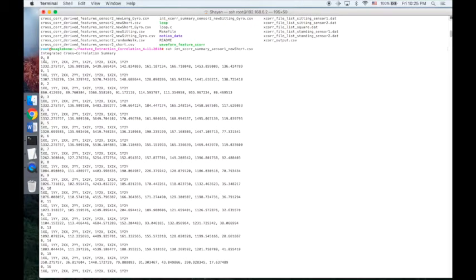Now the 1xx here corresponds to autocorrelation of the first axis that you chose in your first file. And the 1yy column corresponds to autocorrelation of the second axis in your first file. And similarly, it does that for the second file, and the cross correlation of the two columns in the first and the second file.